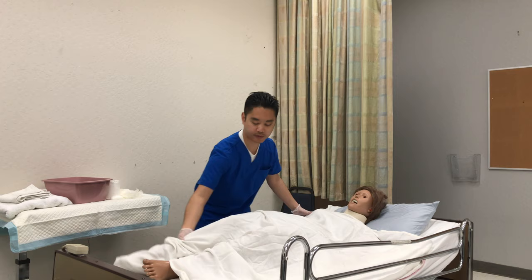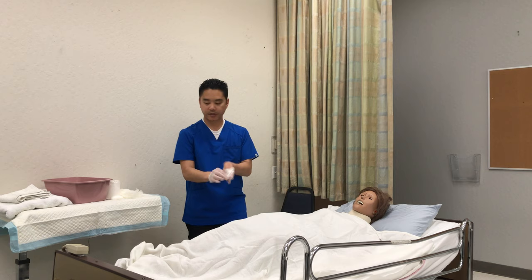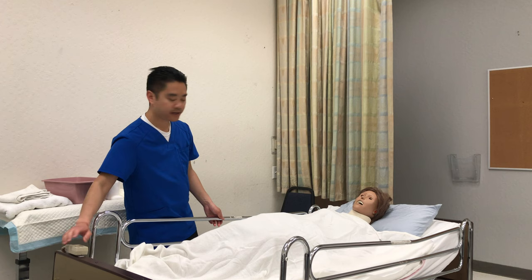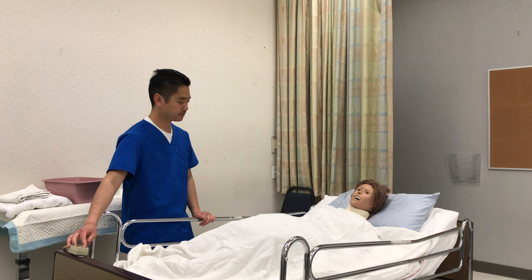On the count of three we're gonna lay back down: one, two, three. How do you feel? I'm gonna remove the gloves, wash my hands, raise the side rails, lower the bed, and raise the head of the bed to a Fowler's or sitting position.